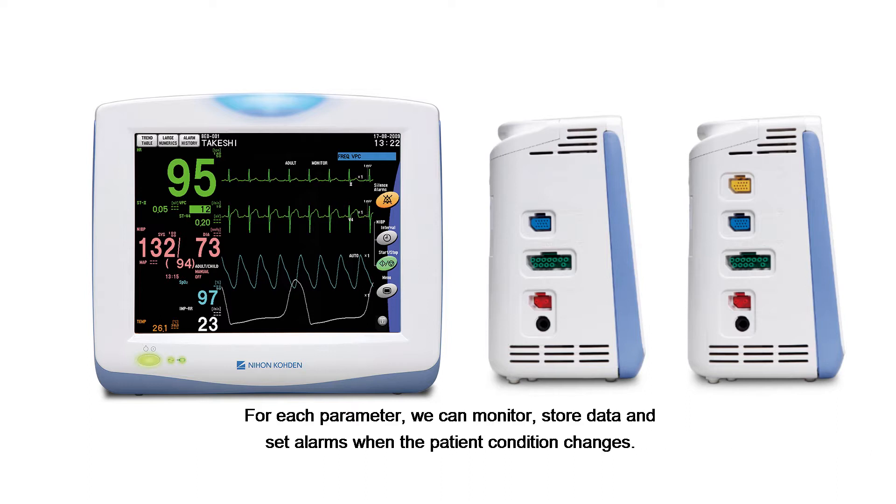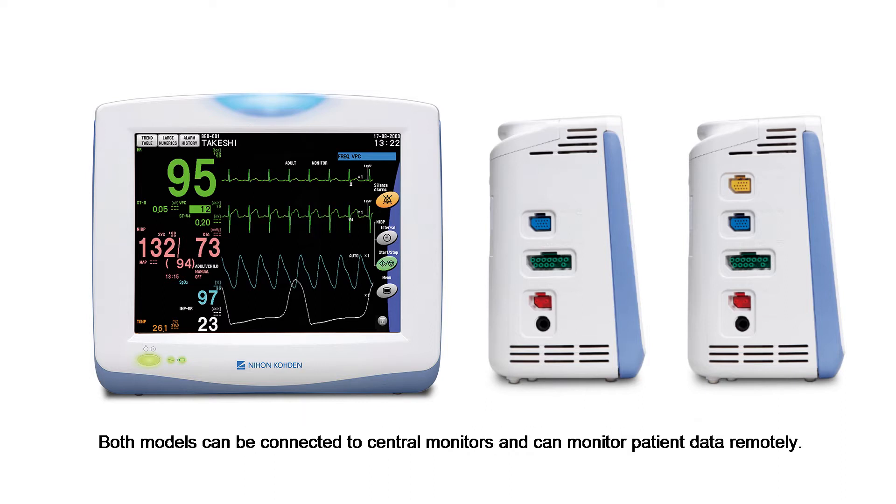For each parameter, we can monitor, store data, and set alarms when the patient condition changes. Both models can be connected to central monitors and can monitor patient data remotely.